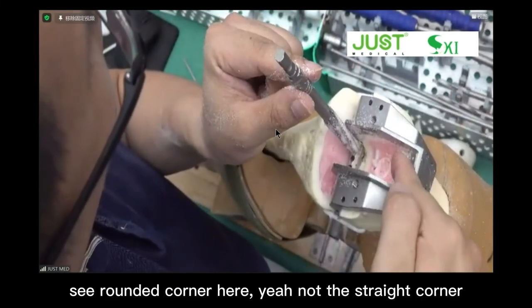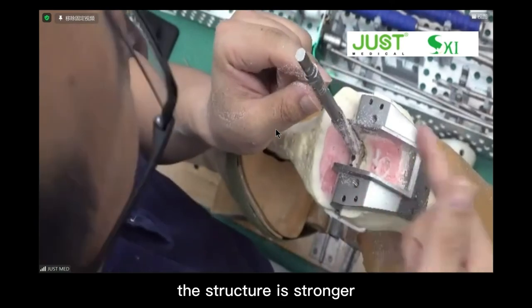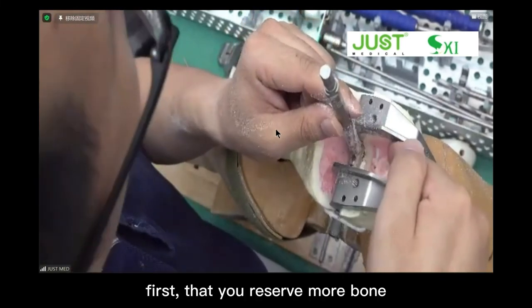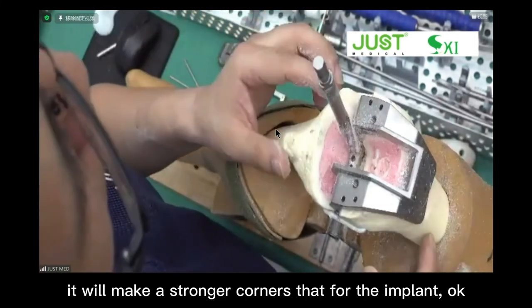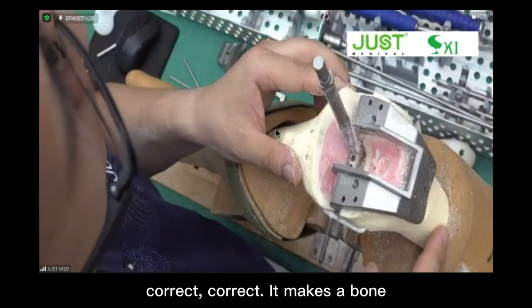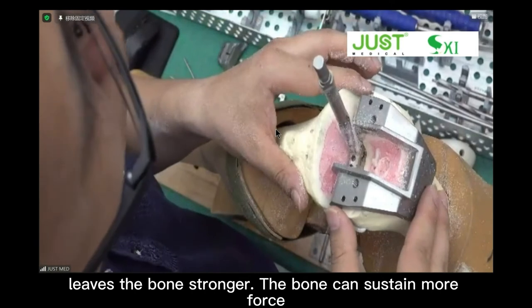See, okay. Round corner here, yeah, not the straight corner. It will make sure the structure is stronger. Okay, stronger than the straight corner. First, you reserve more bone, and it's stronger. Yeah, it makes a stronger corner for the implant. Correct. It makes the bone stronger. The bone can sustain more force.